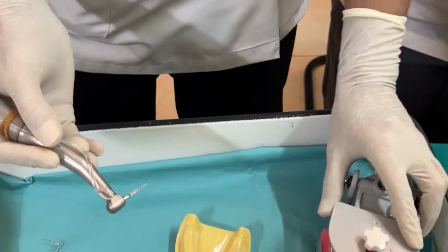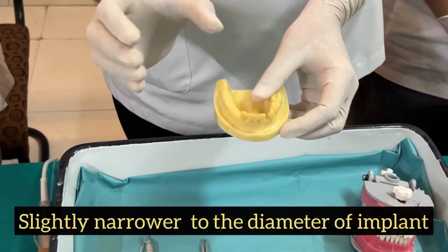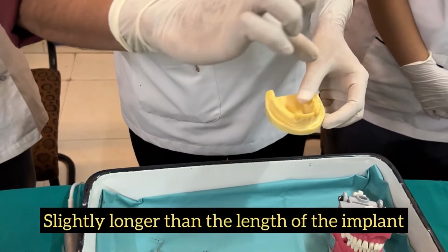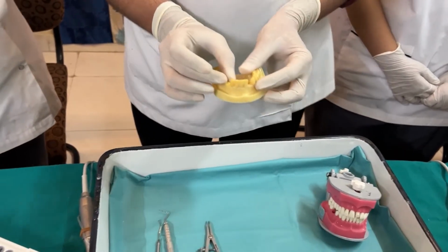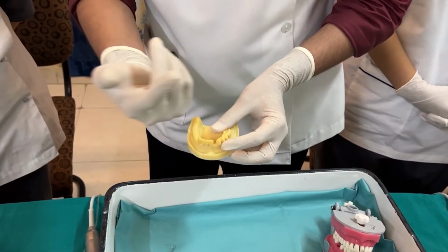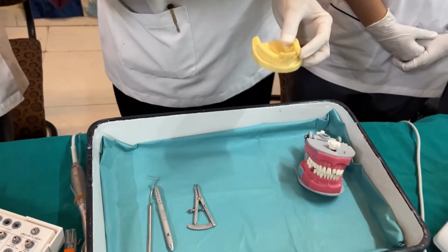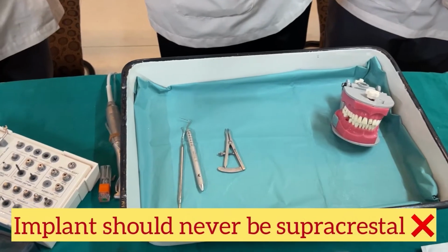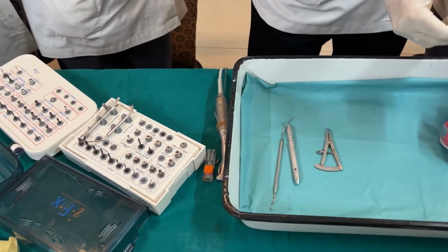The final osteotomy size should be slightly narrower than the diameter of the implant to be placed, and it should be slightly longer than the length of the implant to be placed. Why narrower? We had covered it in the earlier video, because we are anticipating some amount of bone loss because of trauma caused during osteotomy. And why longer? Because the implant has to be either equicrestal or slightly subcrestal, never supracrestal. So if you could just hold it once.